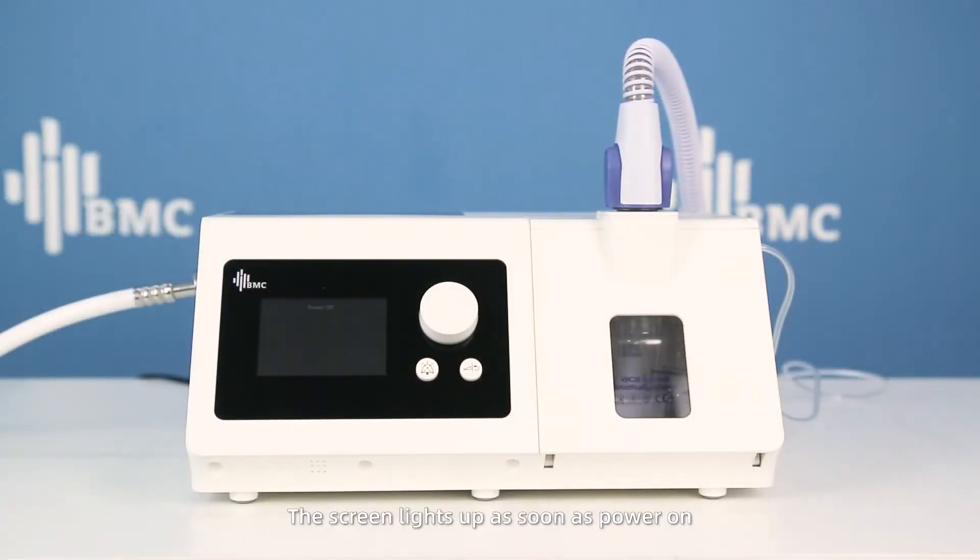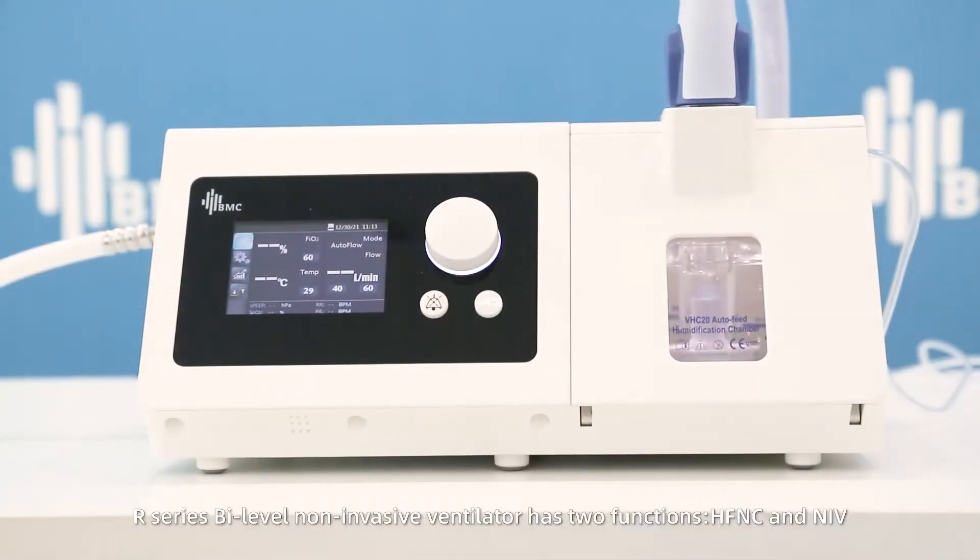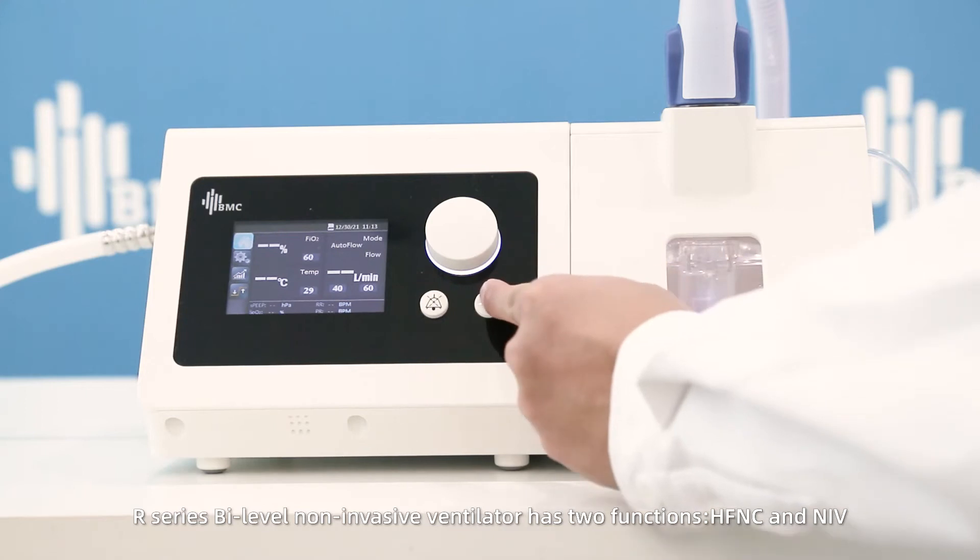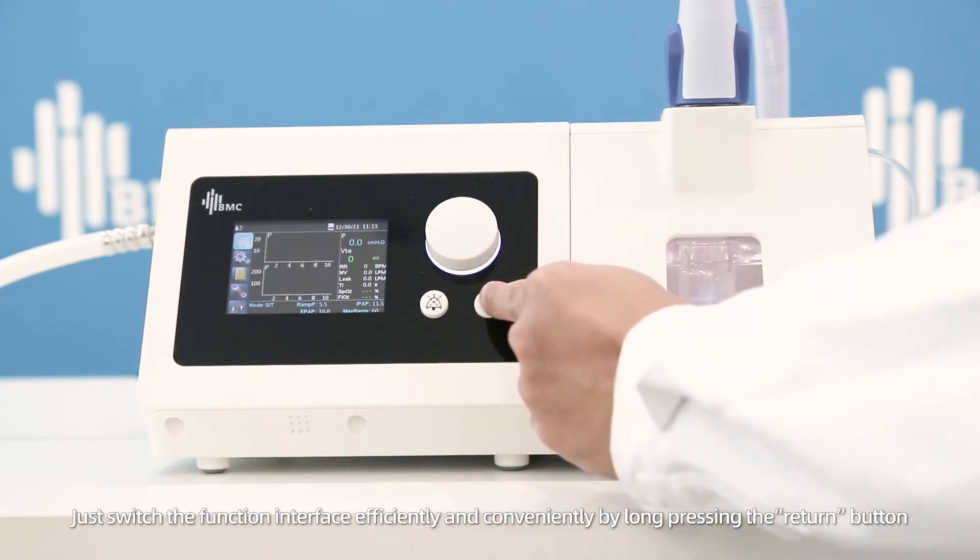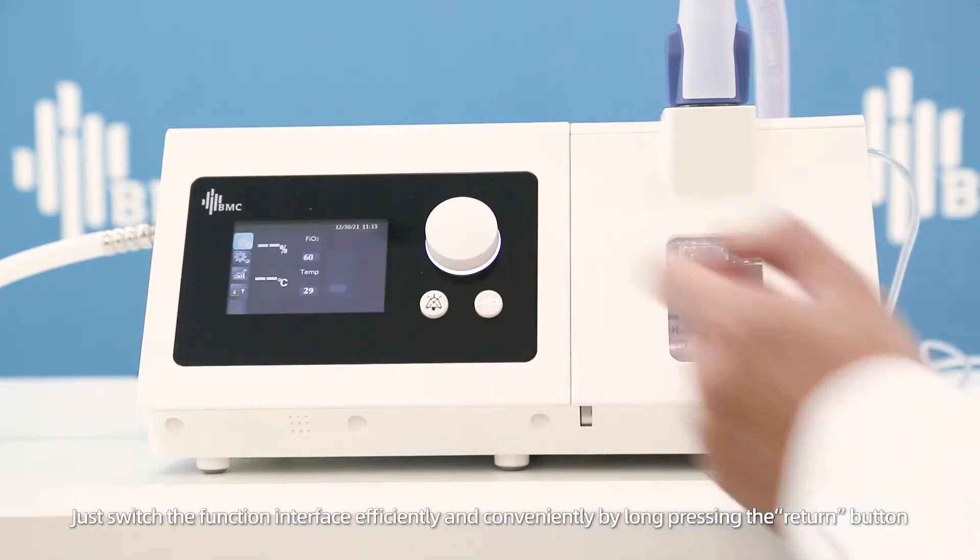The screen lights up as soon as power is on. R-series bi-level non-invasive ventilator has two functions: HFNC and NIV. Just switch the function interface efficiently and conveniently by long pressing the return button.